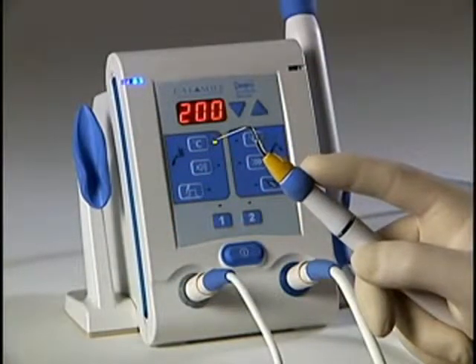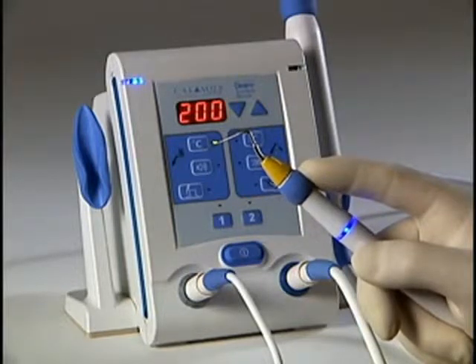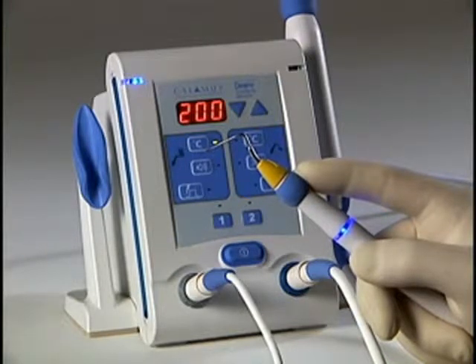As the electric heat plugger's temperature rises, one high frequency tone is heard. Once the tip is within 20 degrees C of the selected temperature setting, the tone will change to a lower frequency and remain at this tone until the activation cuff is released.